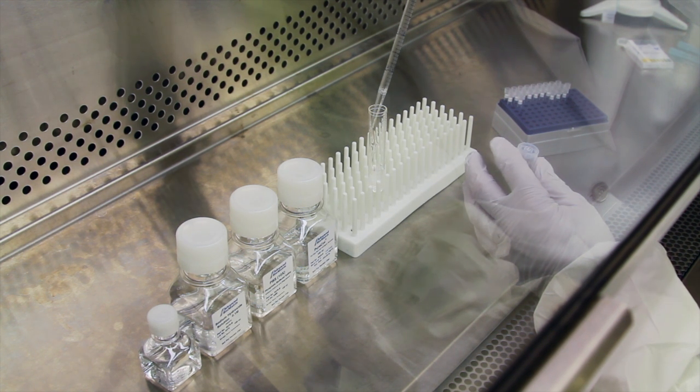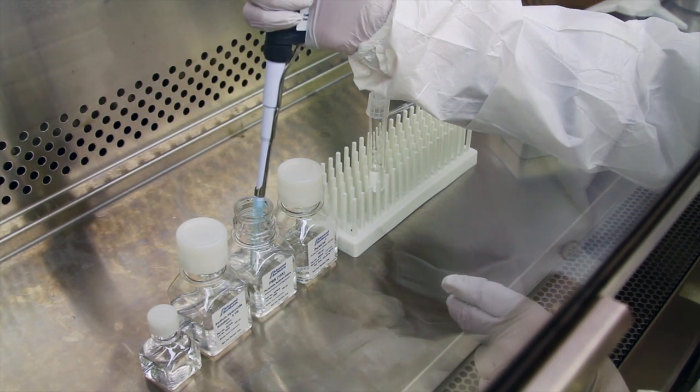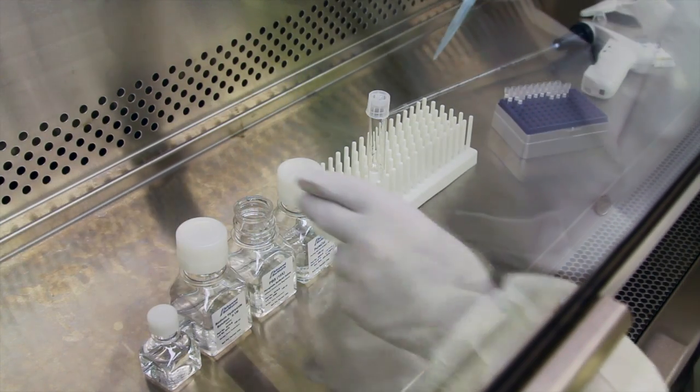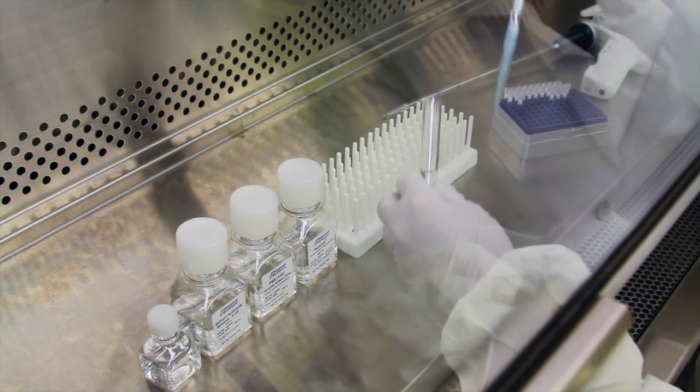Add one part of your chilled sterile 10x media to the 8 parts chilled collagen solution. In this example, pipette 0.5 ml of 10x media directly into the 4 ml of collagen solution.